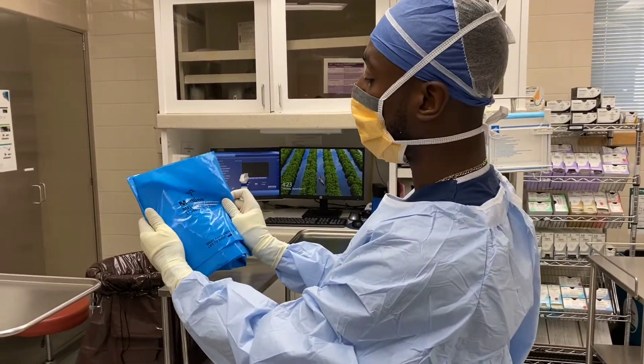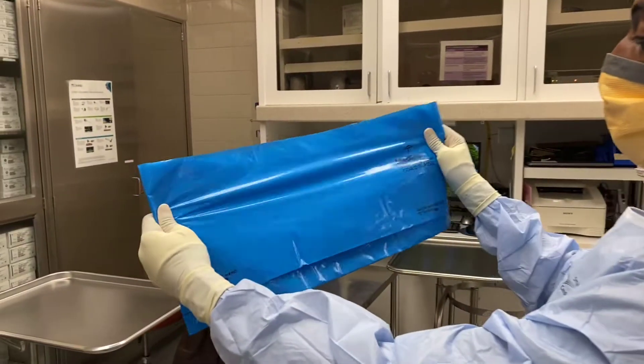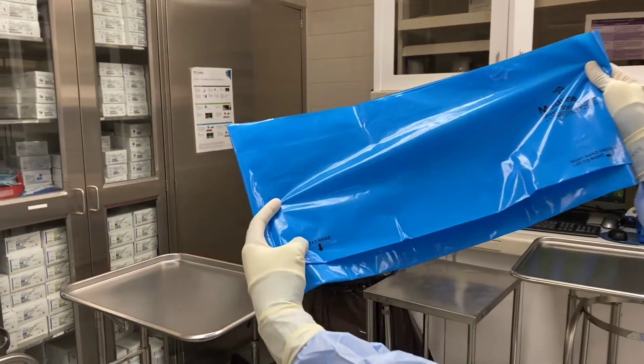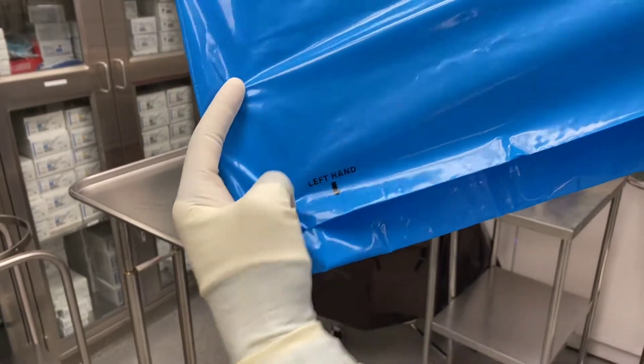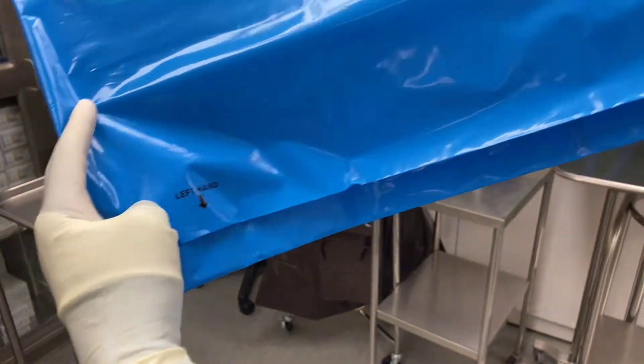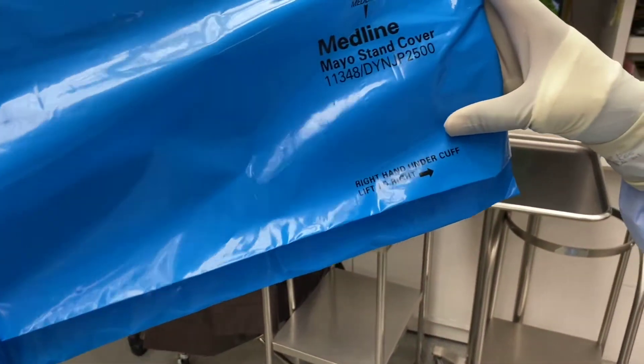What you do is take the drape and open it up. You can see right here on the left it says 'left hand,' and then right there on the right it says 'right hand under cuff.'